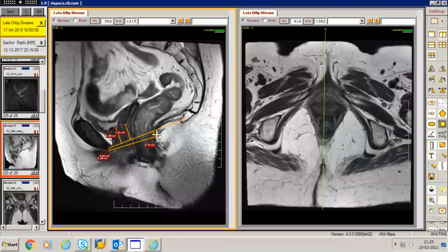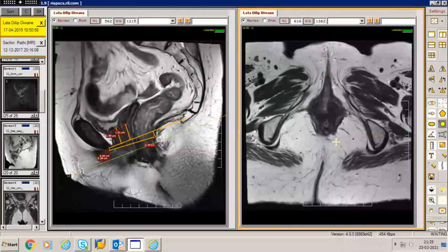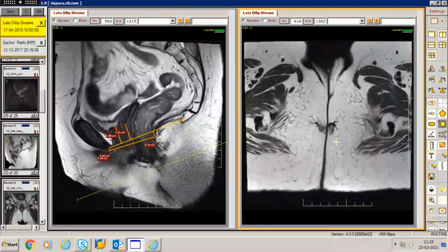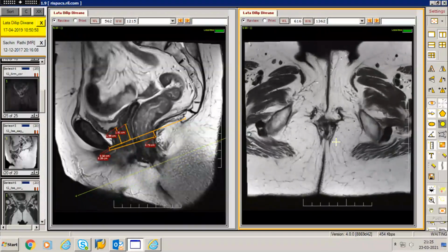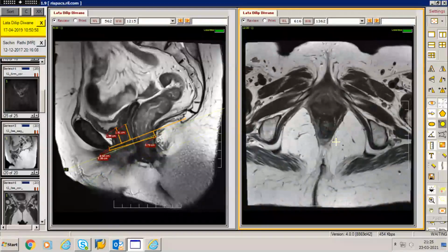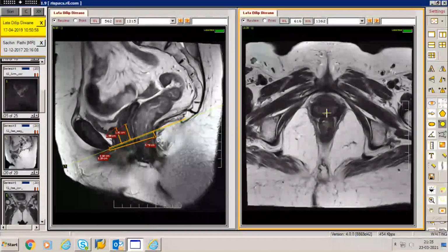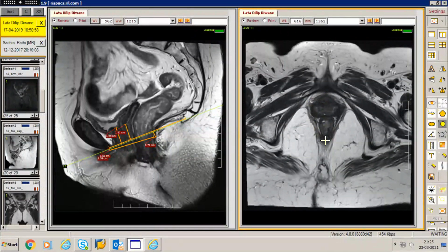So basically, as I was telling you about the hiatus, if I would again show it to you on the cross-section image, you would probably be able to understand this better. Yeah, so this entire thing, if you can see from anterior to posterior, this would be the entire levator hiatus. When I'm talking about the levator hiatus, you're trying to understand the anterior posterior dimension, which extends from the pubic symphysis, coming posteriorly till the puborectalis sling. The anterior posterior dimension is what is governed by what is called the H line.